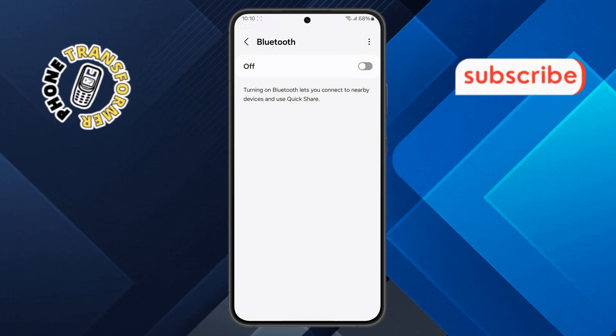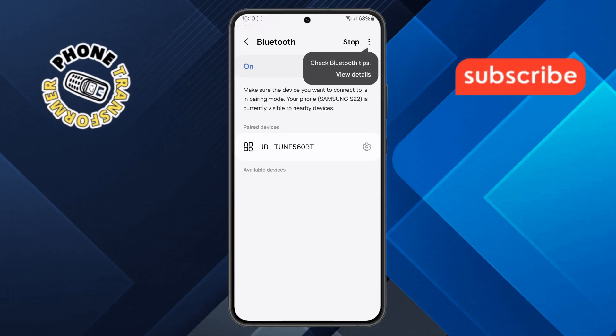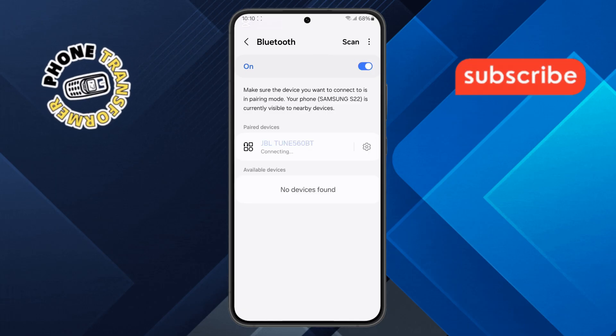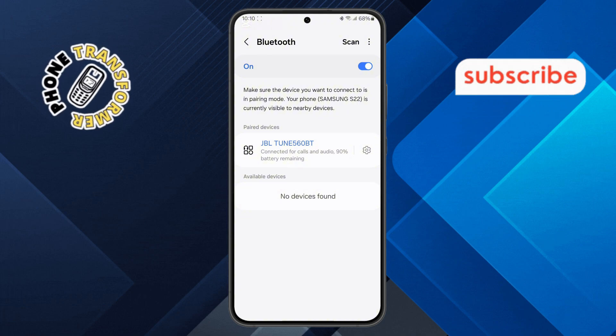Step 6. At this point, you'll need to ensure that Bluetooth is enabled on your device. If it's not already on, go ahead and turn it on. Once Bluetooth is enabled, your Samsung Galaxy device will start searching for available hearing aids. Select your hearing aid from the list of available devices, and once connected, you're all set. Your hearing aid is now successfully paired with your Samsung Galaxy device.